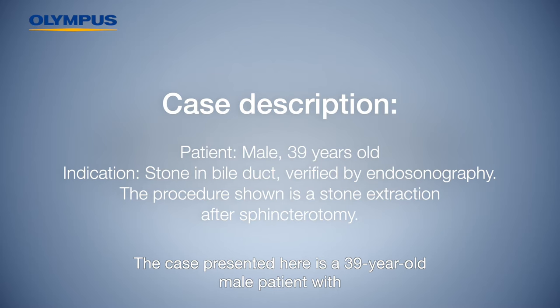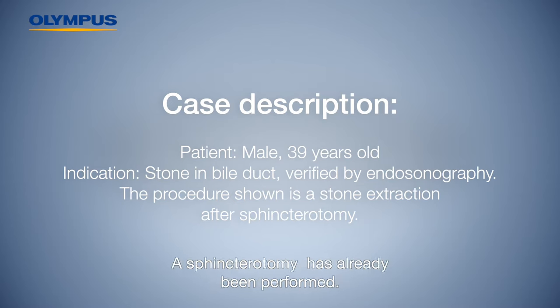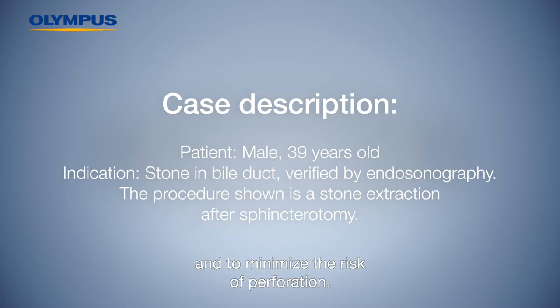The case presented here is a 39-year-old male patient with a stone in the bile duct, verified by endosonography. A sphincterotomy has already been performed and a short guide wire is already in place. A guide wire compatible extraction basket is used for the stone extraction, to establish a secure hold of the stone in the event of a juxtapapillary diverticulum and to minimize the risk of perforation.